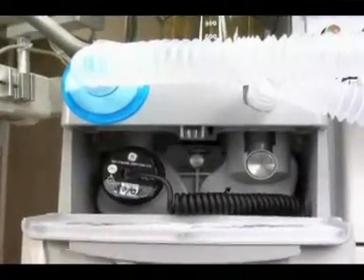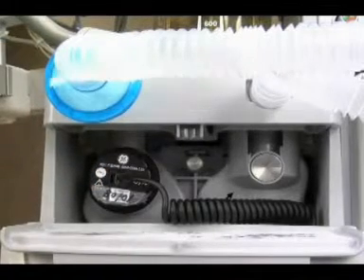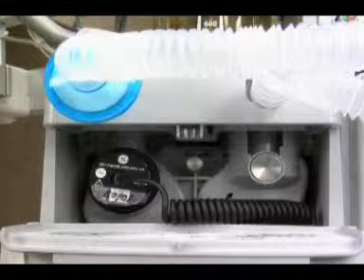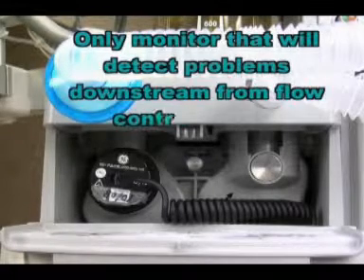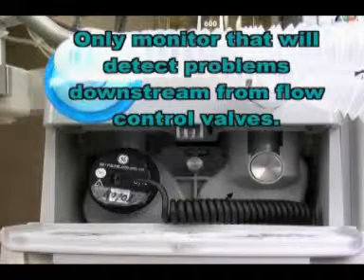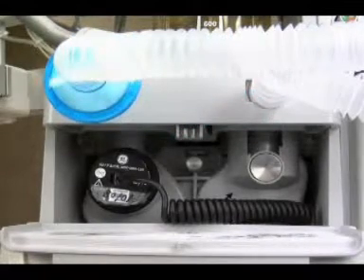The breathing circuit module houses the oxygen sensor. Gases going to the patient pass the sensor, and it detects the percentage of oxygen that is delivered to the patient. This analyzer is the only monitor that will detect problems downstream from the flow control valves. The analyzer must be calibrated during the FDA machine checklist.